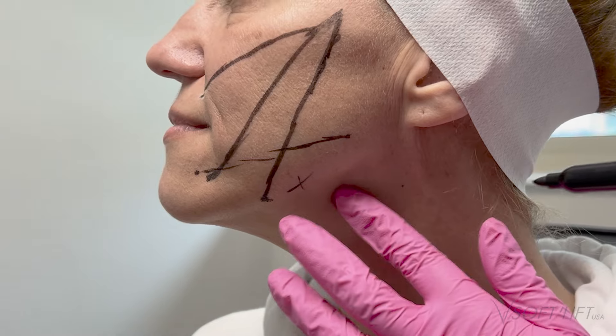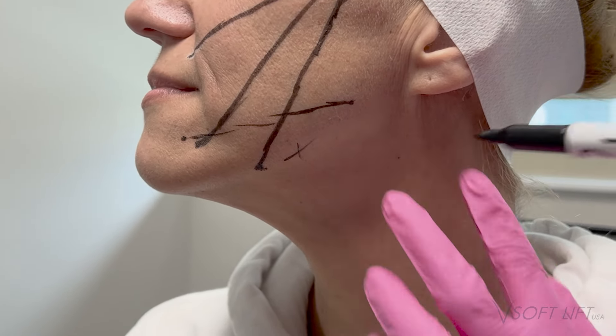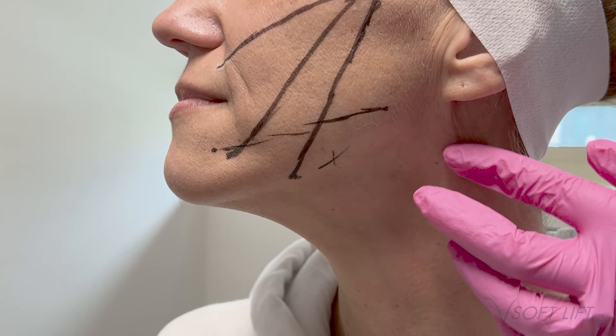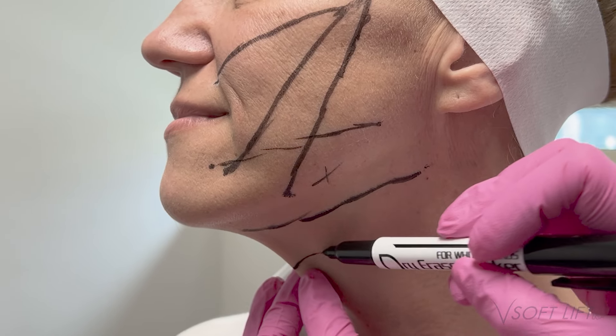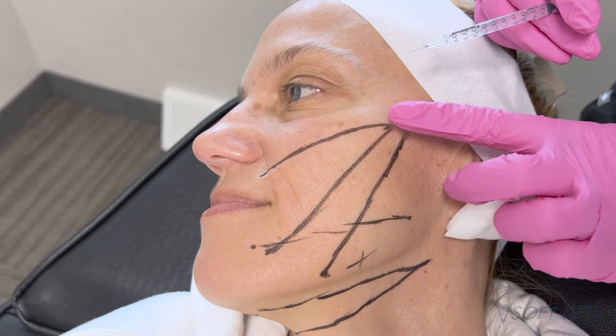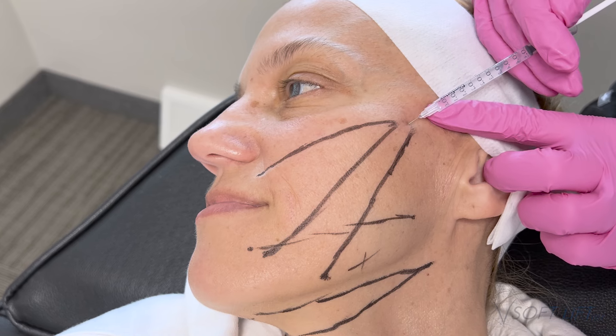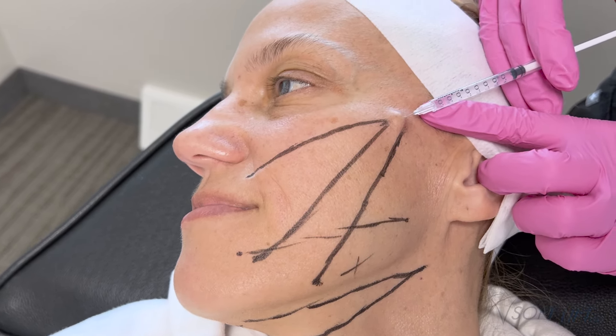I'm temporarily marking my jawline vector — I sometimes end up changing this depending on the lift I get initially from my pilot hole over the zygoma. For her, we're also doing neck threads, so I manipulate the tissue to see where I'll get the best pull, pinching to assess her laxity. I did end up moving this a little bit more forward because I felt I was getting a better lift once she was laying back. These markings are just a guide — we're not married to them. I evaluate the lift as I see it happening.